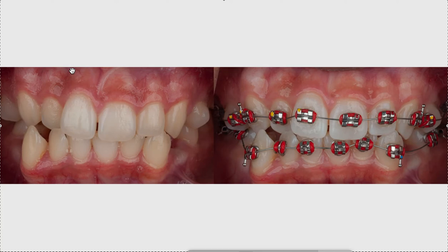You can always go lighter — the worst that happens is it takes a few more weeks but the patient will be more comfortable. The first thing I see here is they didn't fully engage this tooth. The figure eight will really help get the wire in slot — it holds it in tighter. You can do figure eights on everything if you want, though it takes more time to put on and take off. A stainless steel tie or ligature tie is another option, but it's technique-sensitive and you can break a bracket with those.